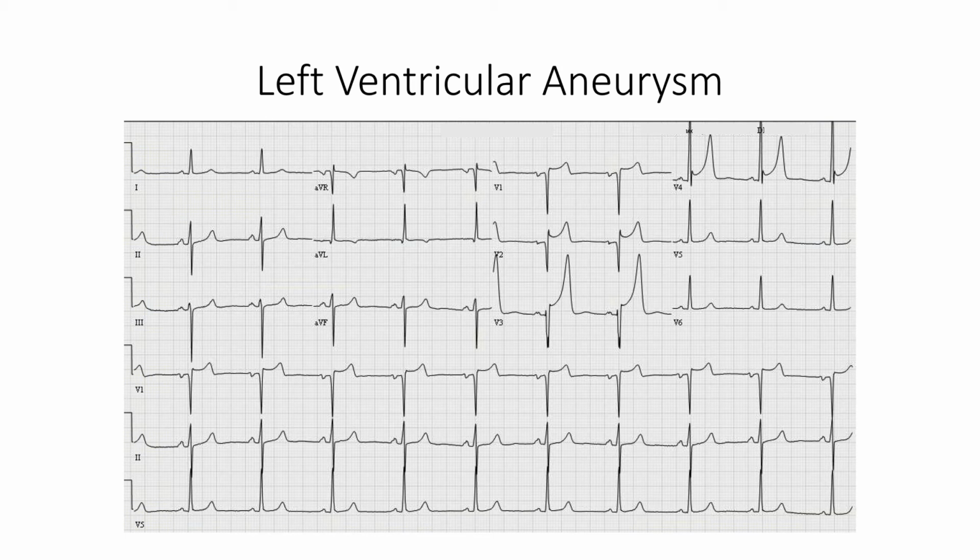But what if I told you the patient did indeed have an MI 1 month ago, but since then has had no further ECG changes and is not currently having an MI? In this case, we would be worried about an aneurysm of the LV, and that this structural change in the heart has caused permanent electrical changes on the ECG.